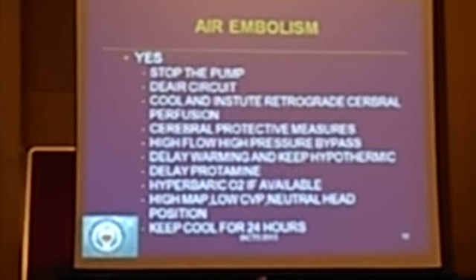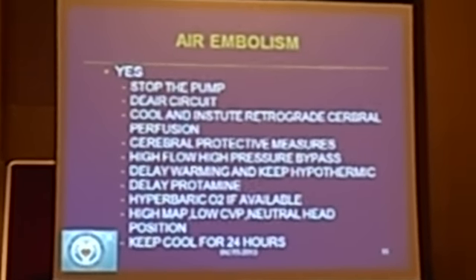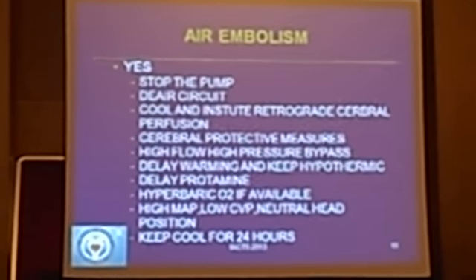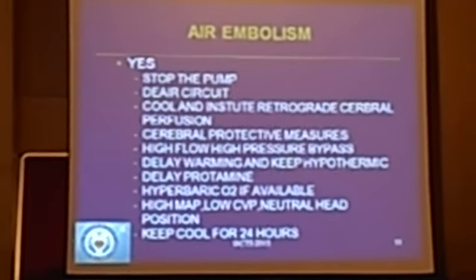Delay warming. Okay? Keep the patient hypothermic. Do not make the mistake of rewarming up to 37. Keep it at 34, 35. Delay protamine as much as possible. You want gas to absorb, you don't want clots to form in the brain.